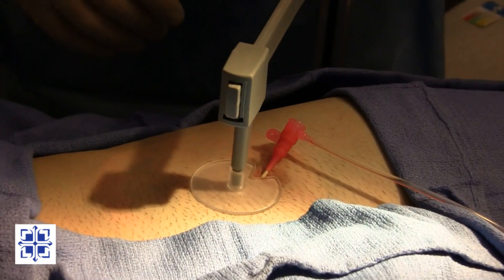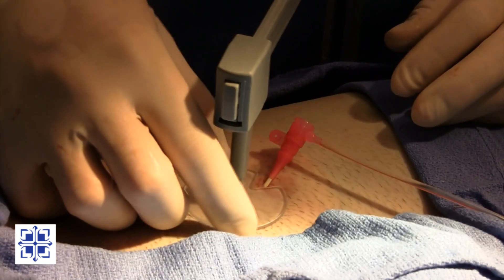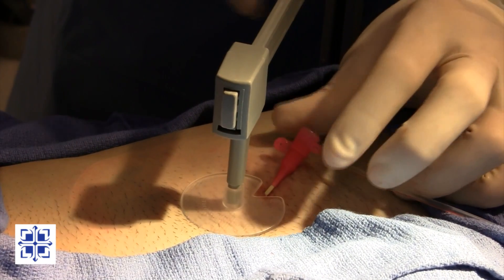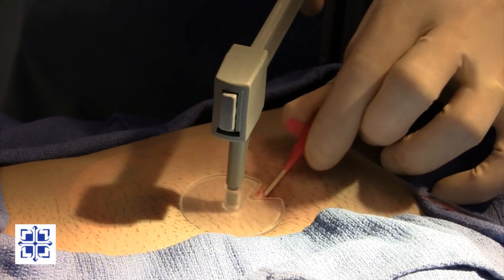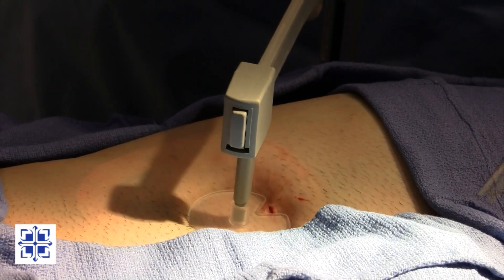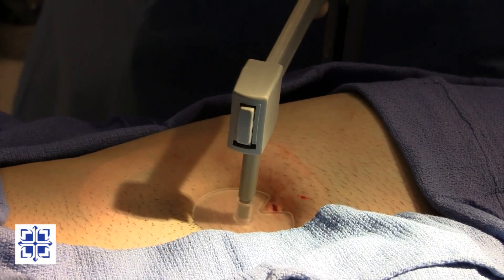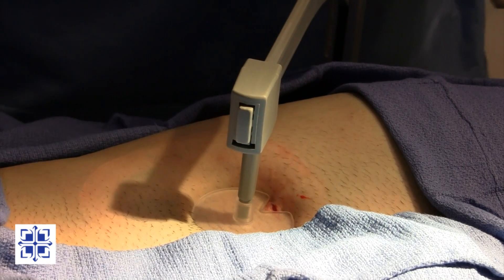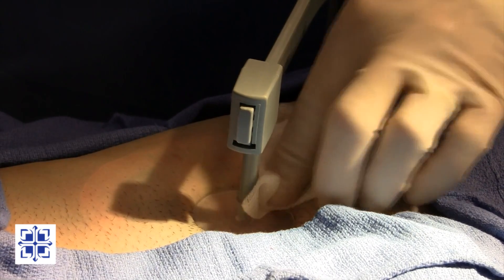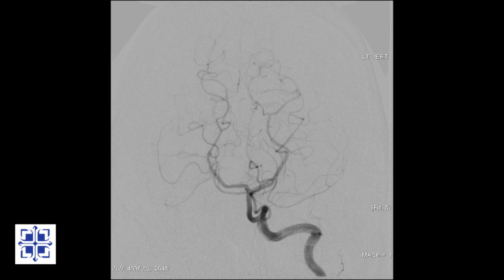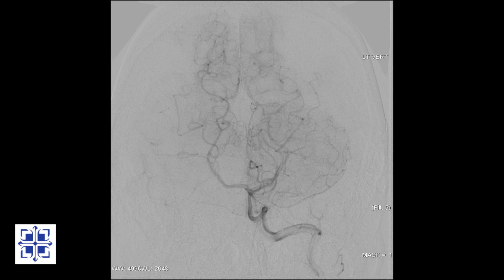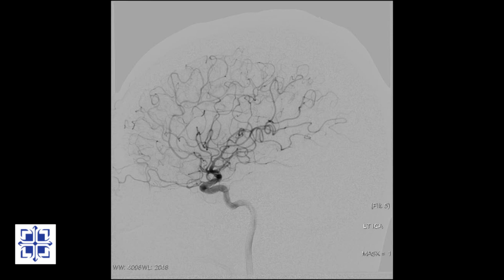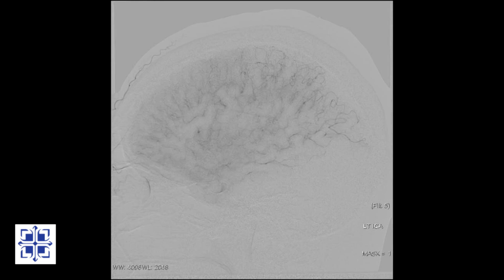Having removed the catheter, it is time to remove the sheath. To prevent bleeding after sheath removal, pressure is applied. After about 15 minutes, pressure is relieved and this patient is transported to recovery for 4 hours of bed rest. While our patient is recovering, all the pictures are carefully studied. Later today I will give results to our patient and a report will be available to his referring doctor.